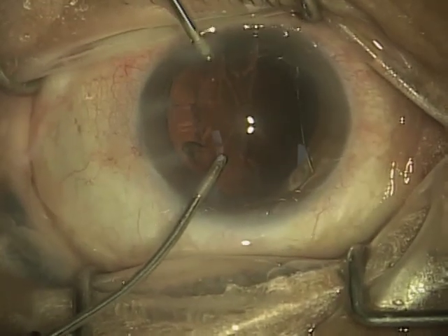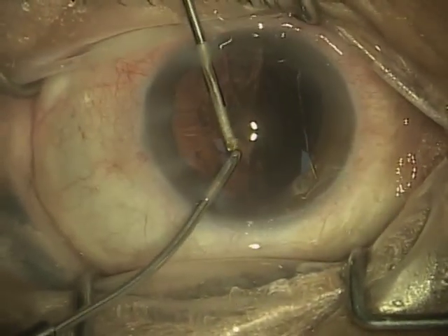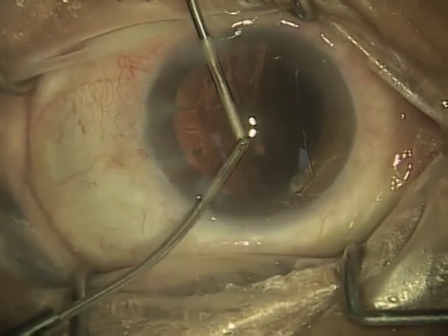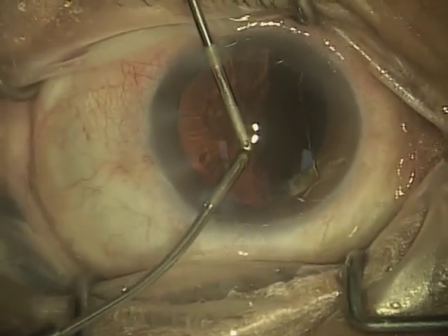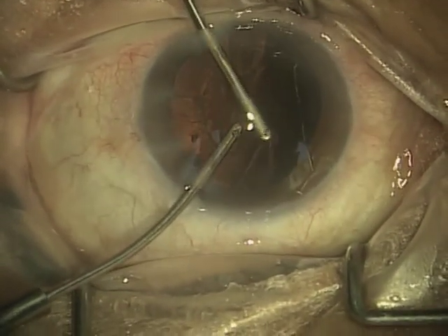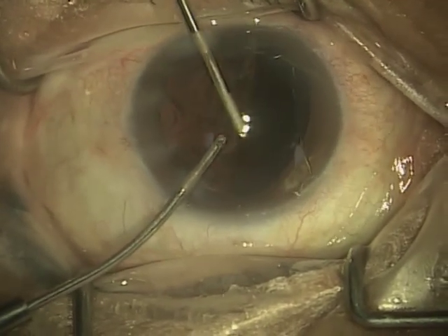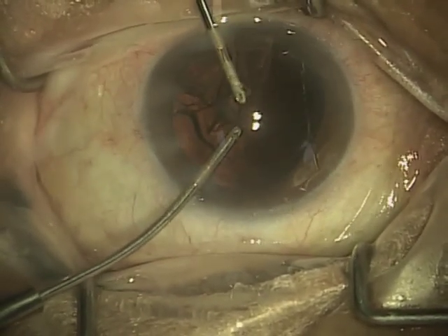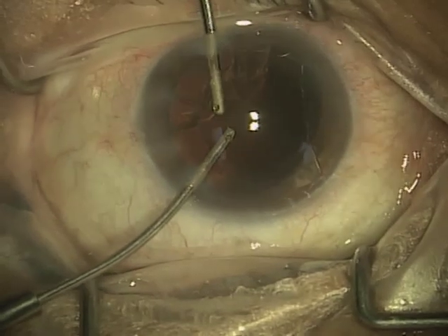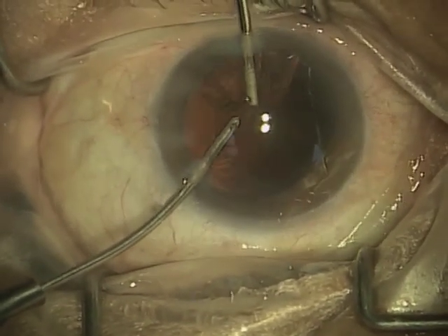So first I put in the irrigating handpiece, and then up from the top of the video you see the aspirating handpiece. You'll notice that the irrigating handpiece reflects light more, and at the aspirating handpiece, the tip looks like it's been sanded, and that's actually intentional. The tip actually has a kind of a rough edge that allows me to polish the capsule itself.